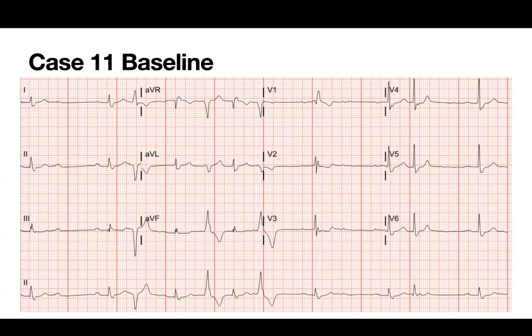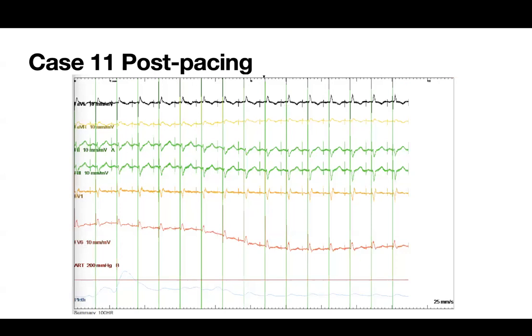This case was done last week by my colleague. I just wanted to show it for one thing. It's a guy with frequent PVCs, AV block, right bundle branch block. I just wanted to show the utility of pacing from the anode to know if the anode is in or not. So go next.